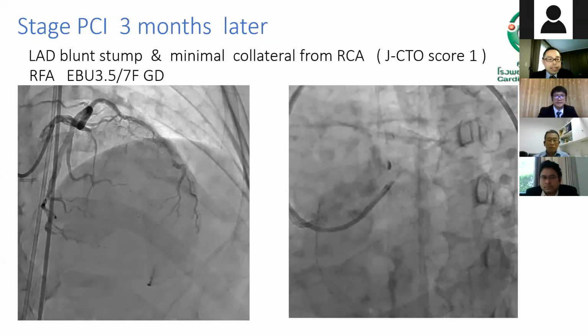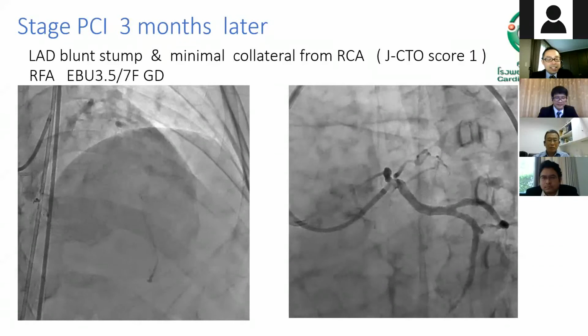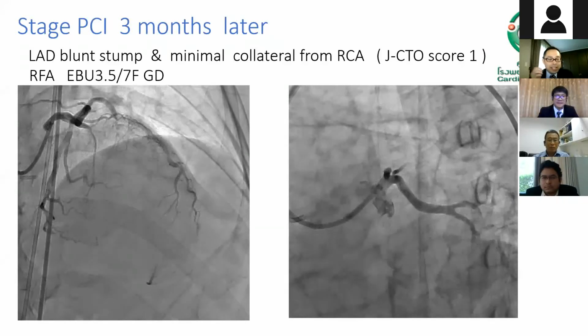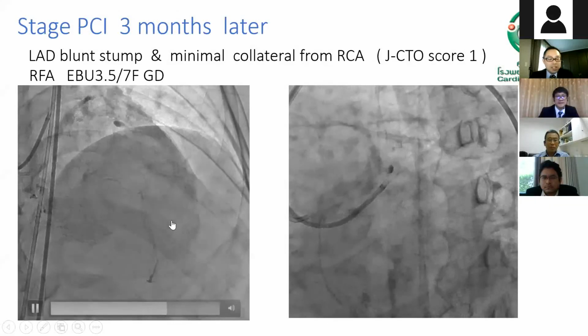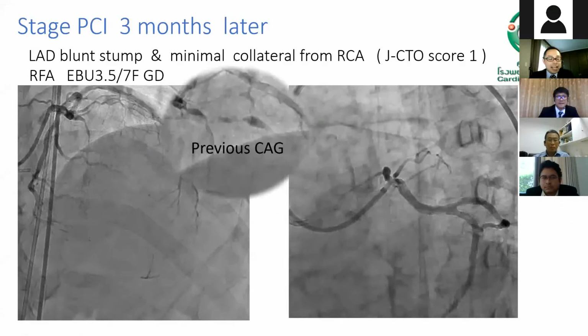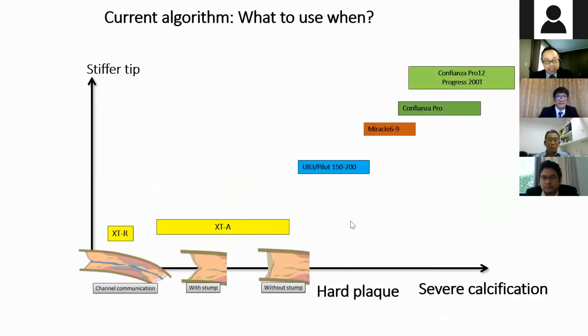Anyway, as to which is better, XT or XTR: the handling and maneuverability of this XTR guide wire is very good compared with the XT. I usually use the XTR guide wire.